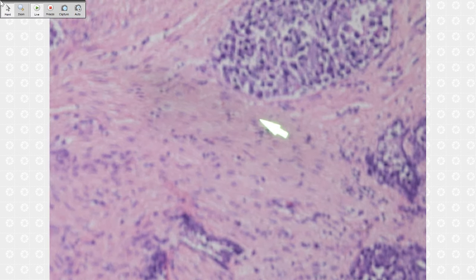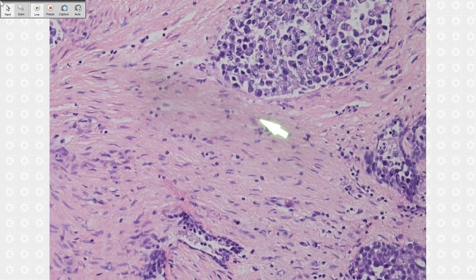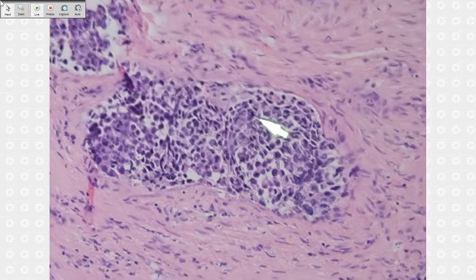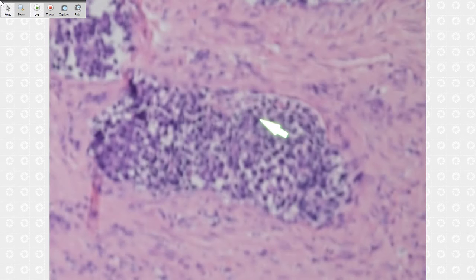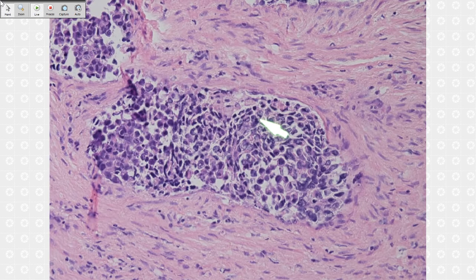First thing, I know the patient has a CIS. So when I saw this, what differential diagnosis did we make here? CIS growing into the prostate glands. What else do you have to think about? Prostate cancers, metastatic cancer, or could be prostatic adenocarcinoma, could be intraductal prostatic adenocarcinoma.